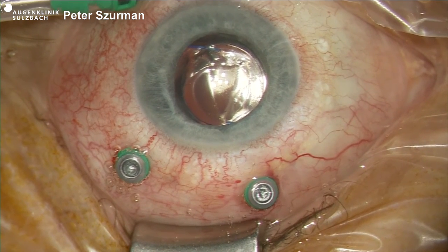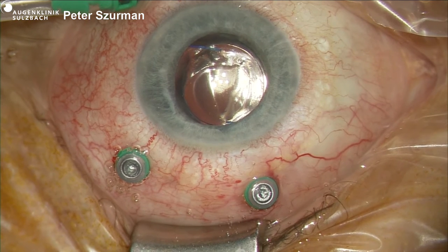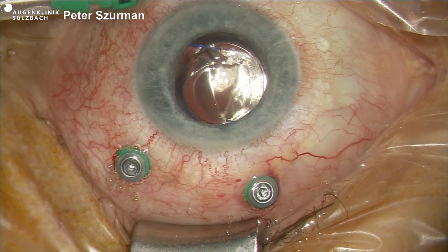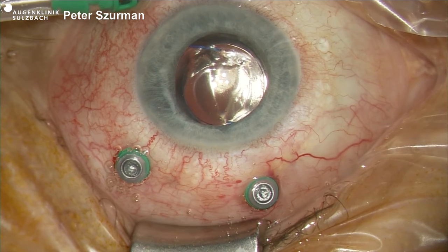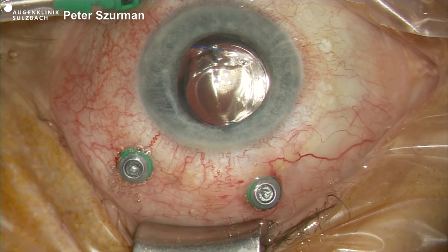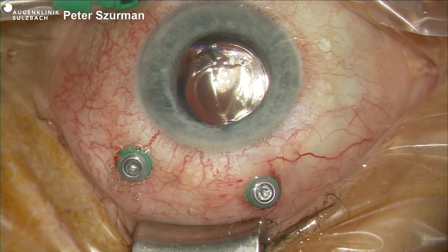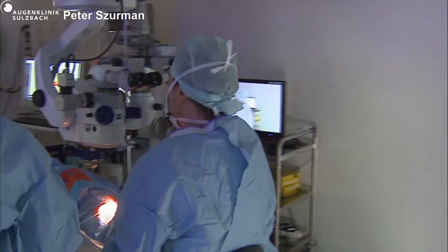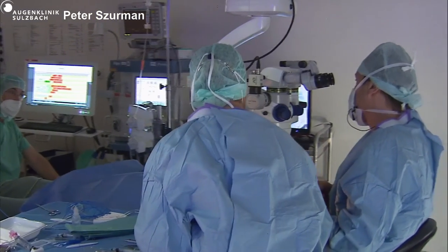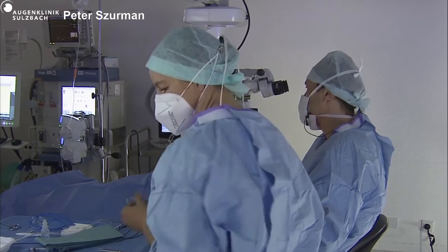A retina patch from the periphery for persistent macular hole, and this was part of a series of these 80 persistent macular holes. Two cases were done with neuroretina, and in both cases the break didn't close, and the neuroretina was only atrophic. It disappeared within 3 months. There was no bridging of glial tissue, not at all. It was just a necrotic piece of tissue that disappeared after 3 months. So I'm a little bit disappointed, although I think a retina patch is easier to handle than an amniotic patch.